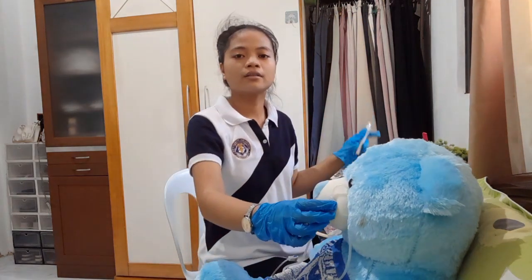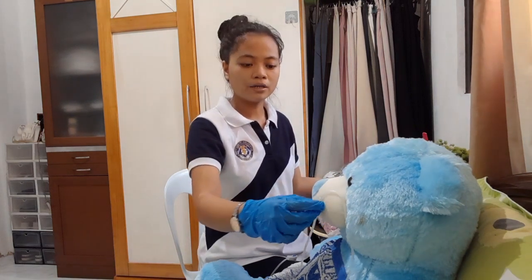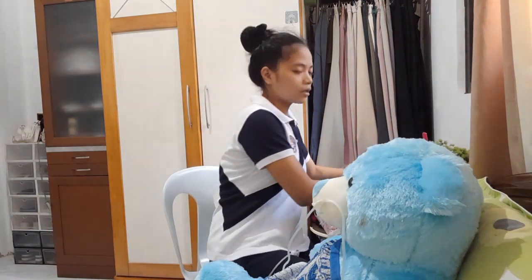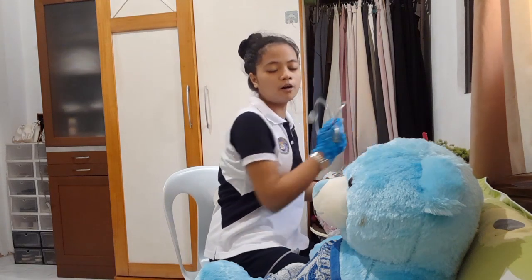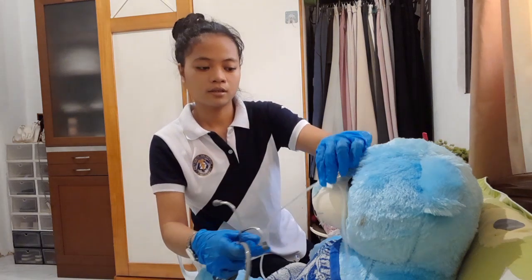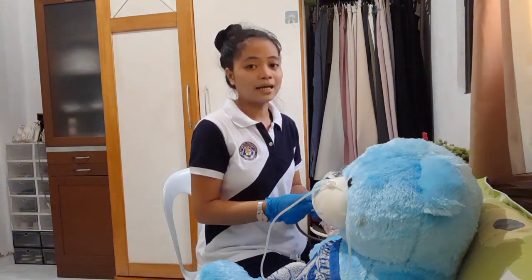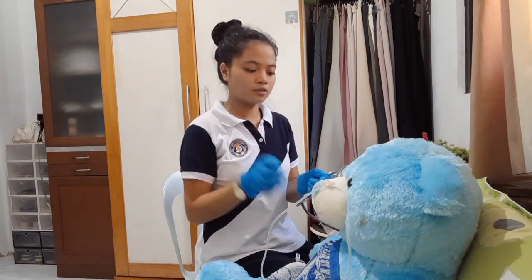Then, we're going to check the correct placement of the nasogastric tube by using two or more of the following. So, first is to aspirate for stomach contents. So, assuming na lang pong nakalagay ito. Then, we're going to check the pH of the aspirated stomach contents.